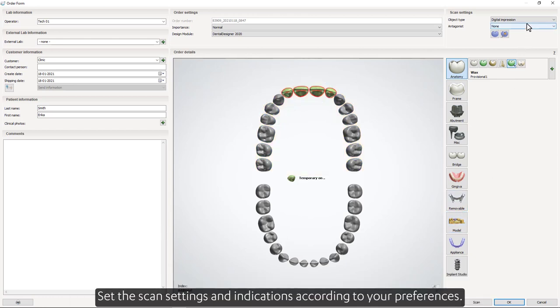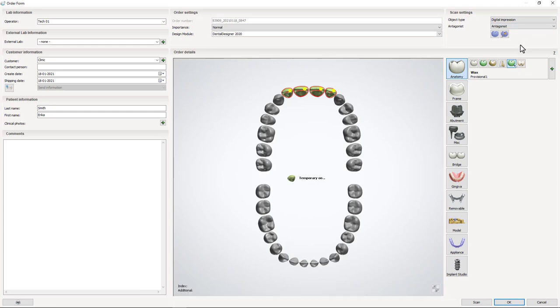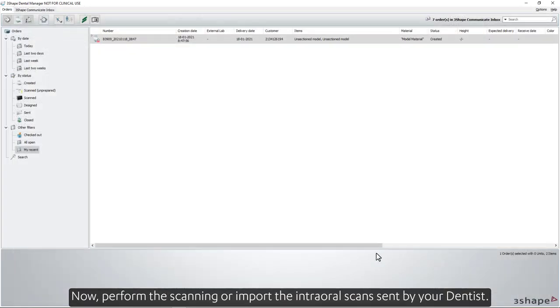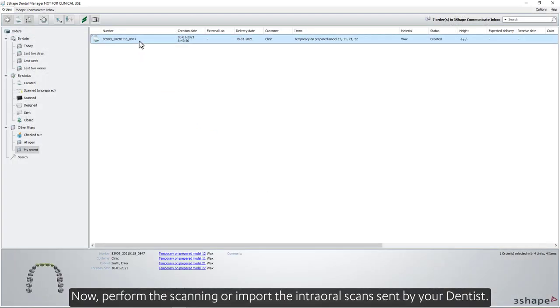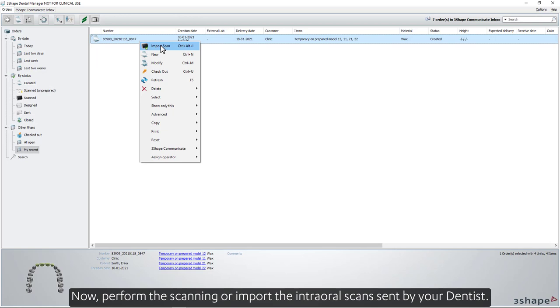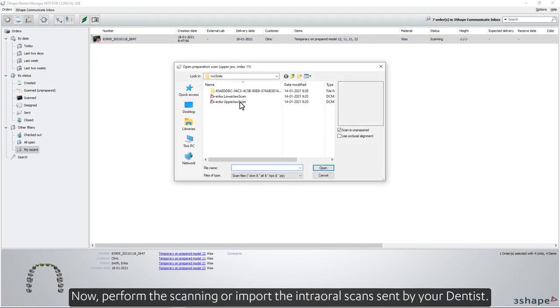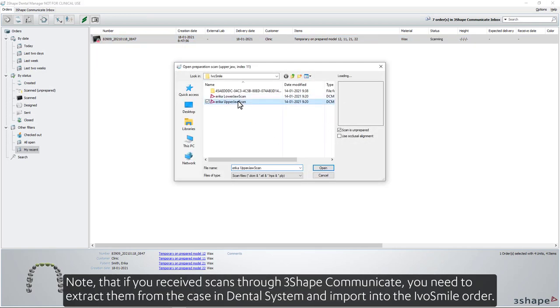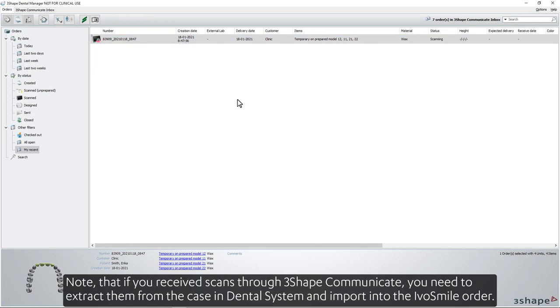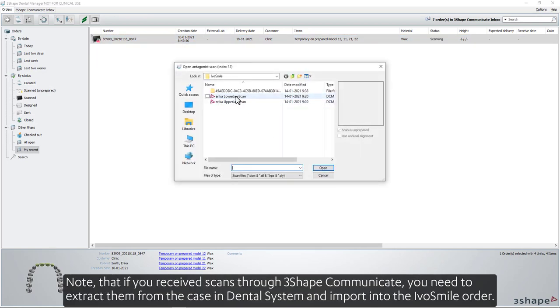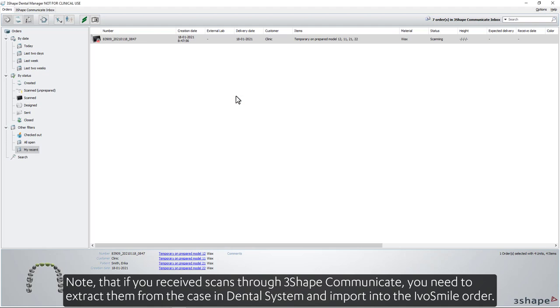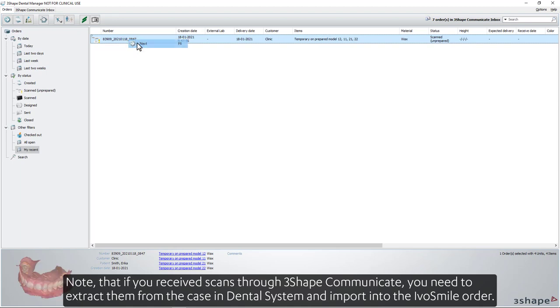Set the scan settings and indications according to your preferences. Now, perform the scanning or import the intraoral scans sent by your dentist. Note that if you receive scans through 3Shape Communicate, you need to extract them from the case in Dental System and import into the IvoSmile order.